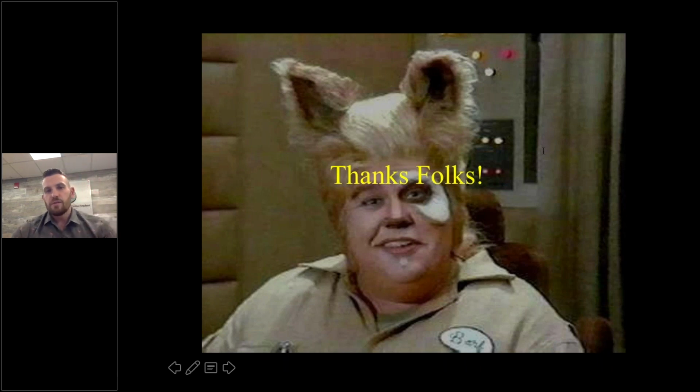Okay, so it looks like the first question from John is, did you also tack the membrane of the palatal aspect of number 14 in case 1? And the answer to that is no. You can tuck these in as long as you're planning to have primary closure of the wound. For me, you can suture it in too, but if you are planning to have primary closure and at least some of it is fixated, or you have it fixated in your periosteal pocket, you're okay to get primary closure over it and it won't move. I really hope that answered your question.